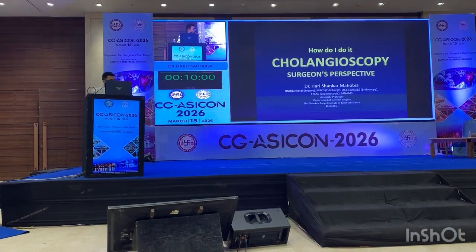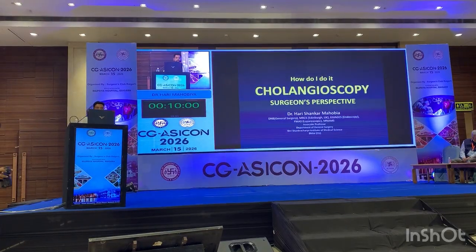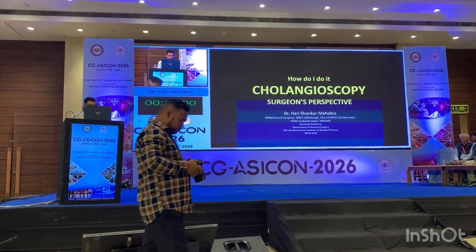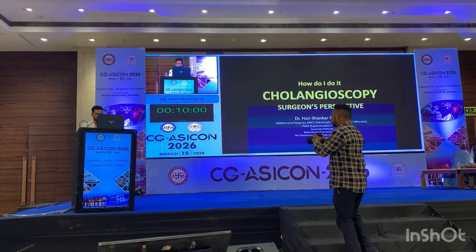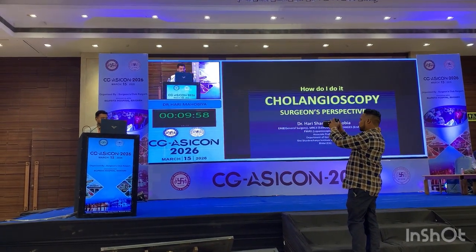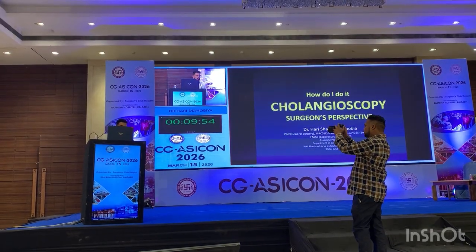So this is the video presentation of how I do it. It is a cholangioscopy. I already talked about the surgeon's perspective on this. So this presentation is all about how we deal with the CBD stone in our setup.